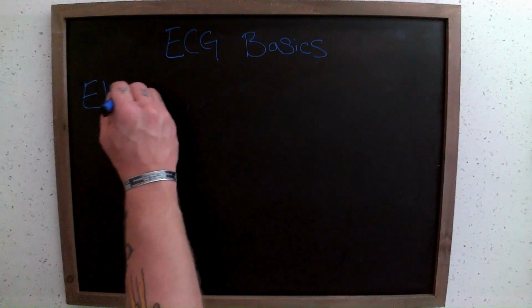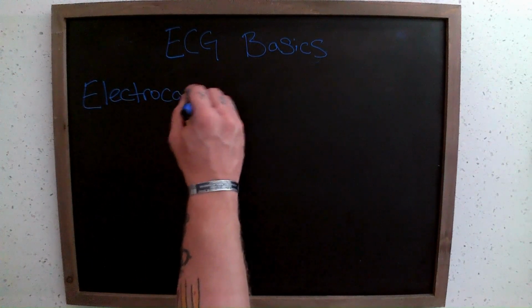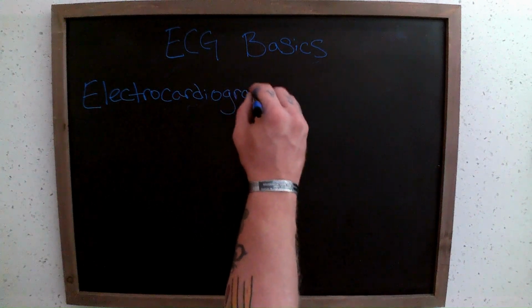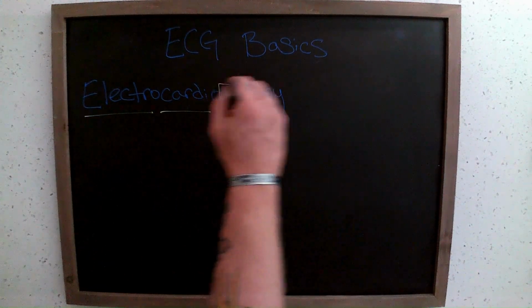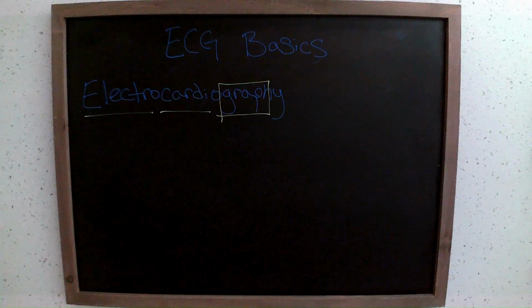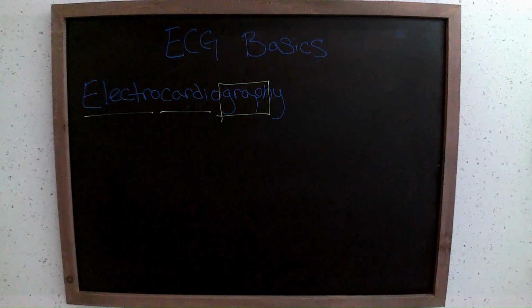Today we're going to quickly discuss the basics of what an EKG is. EKG stands for electrocardiography. When we break that down, we have the electricity in the heart represented in graph form. This is all completed from our EKG monitor.